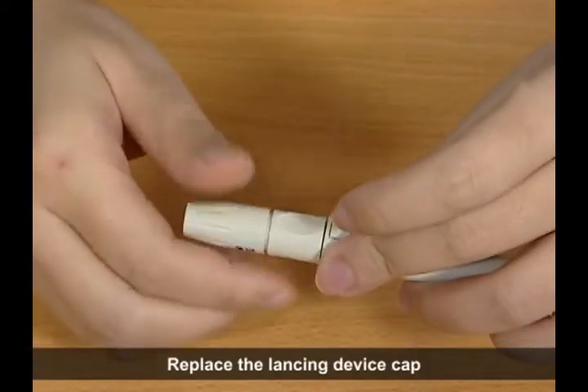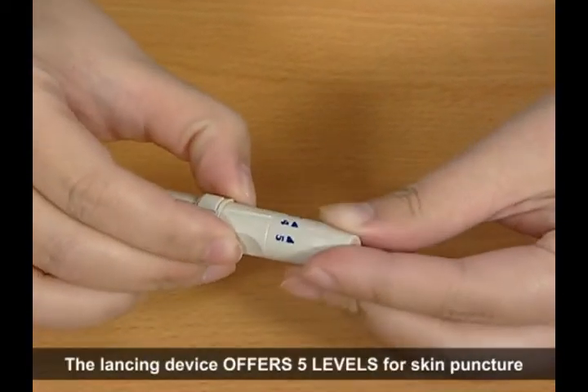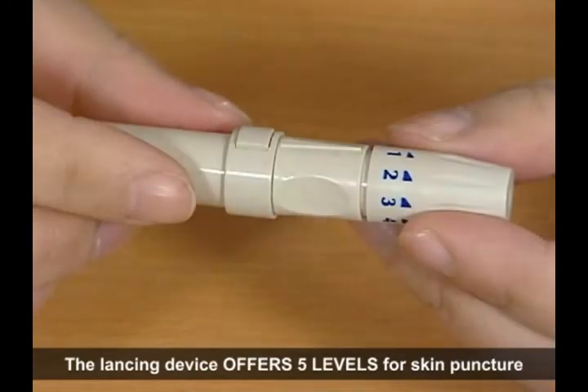Replace the lancing device cap and set the puncture depth to the desired number. The lancing device offers 5 levels for skin puncture.